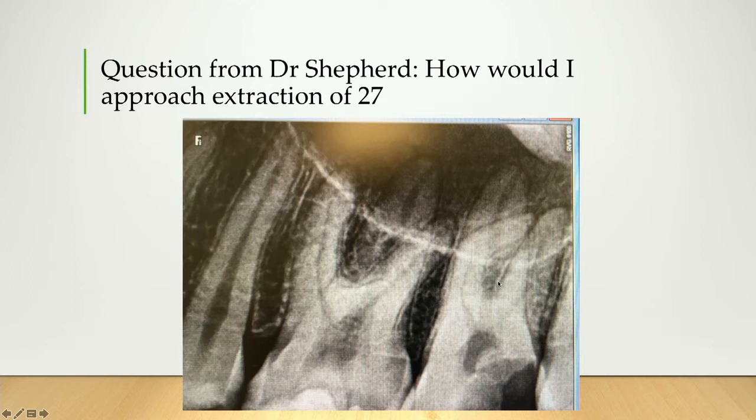So we had an X-ray sent in from Dr. Shepherd, so thank you for sending your X-ray through. Her question was, how would I approach the extraction of the 2-7 tooth? So it's a really good question. Thank you for sending it. And obviously we've got decay here that we can see on the 2-7 tooth.